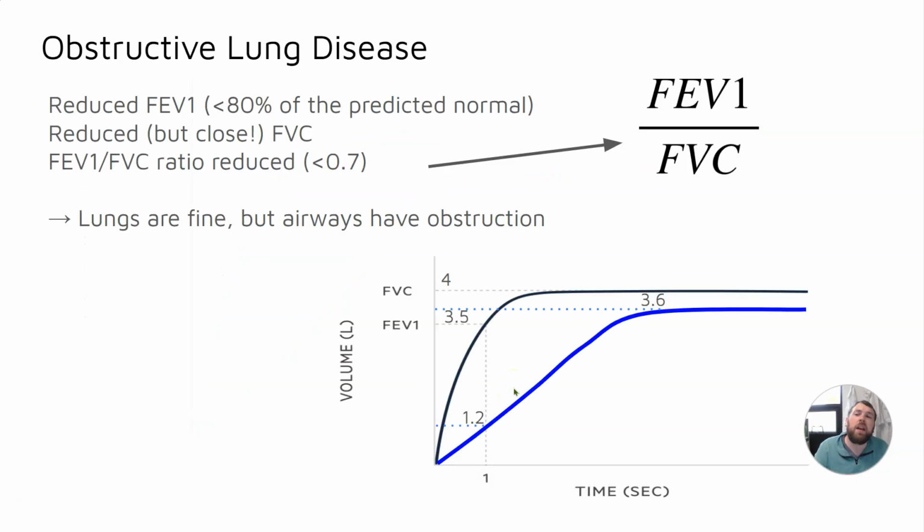And this would indicate obstructive lung disease, meaning that something is in the way. Lungs are absolutely fine, but the airways have some obstruction, reducing the airflow through the lungs to prevent that air from getting out, or in this case, getting in as well.